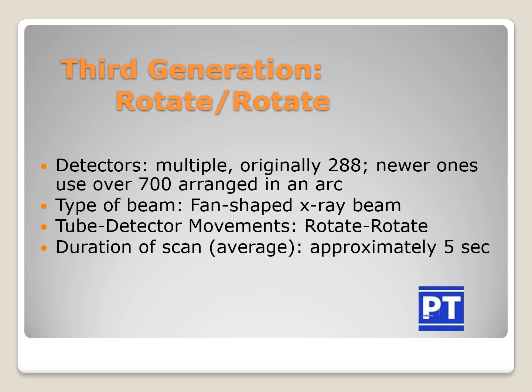This third generation CT is now termed conventional CT. Here the detector number has increased from 30 to around 700 detectors, and we are using a fan shaped X-ray beam, same as the second generation, but the fan beam width has been increased, so that a single slice covers the whole area.